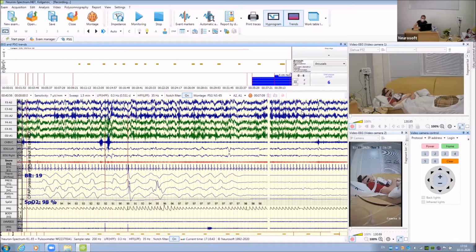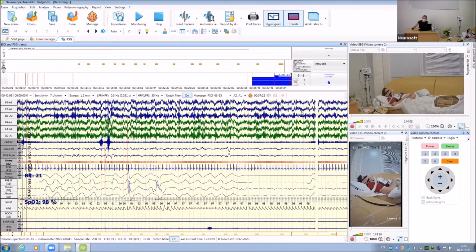And we are waiting for 10 seconds. Thank you, Anton. We have some central apnea now. It means that our pressure is not effective, and we increase the value.